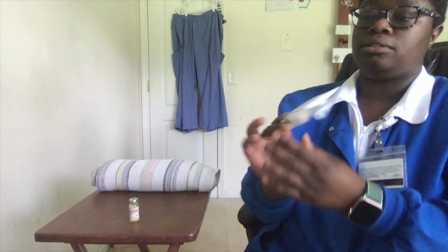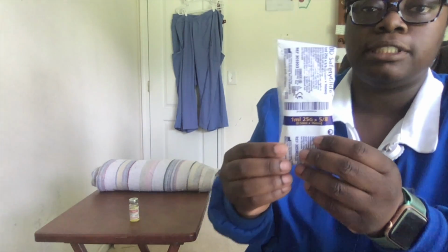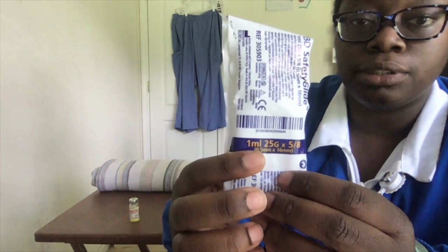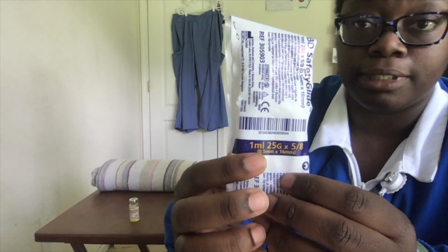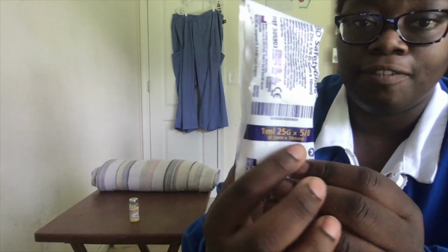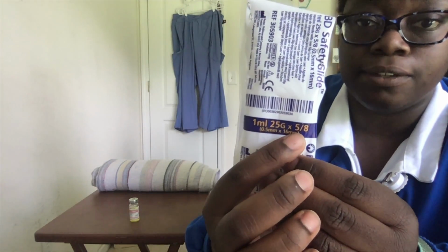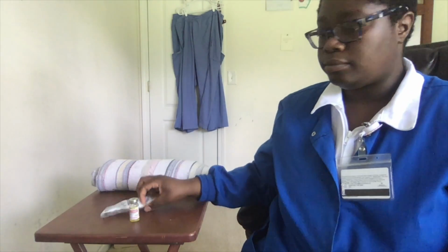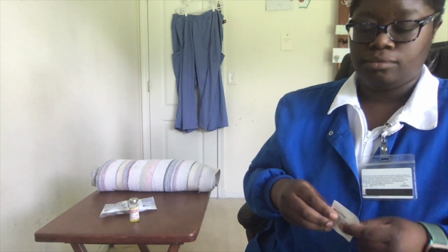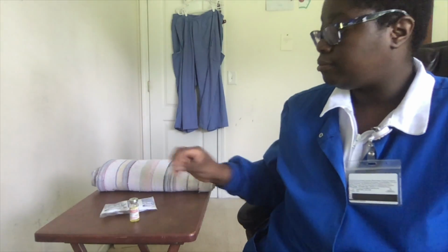Seeing as how this is a subcutaneous injection, I'm going to need a 1 milliliter syringe, which is also known as a tuberculin syringe, as well as a 25 gauge 5/8 inch needle. And an alcohol prep pad.